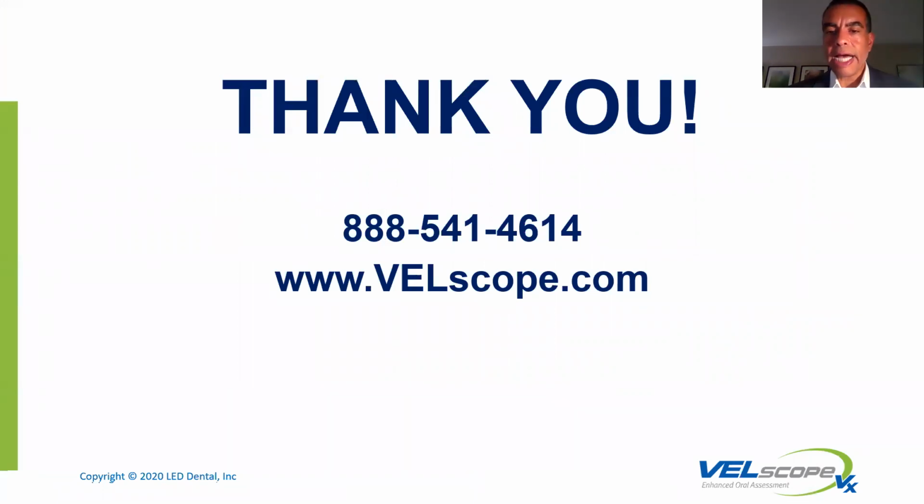So thank you so much for your time. Thank you for your purchase of the VELscope and joining the VELscope family. We are confident that if you incorporate this into your practice, you make this a priority in terms of the care that you offer your patients. Not only are you going to achieve gratification, not only hopefully your patient's going to be happier, but we literally can have an impact with this disease that in the long run we know will impact hopefully the overall health and more importantly, the reduction and elimination of this horrible disease.